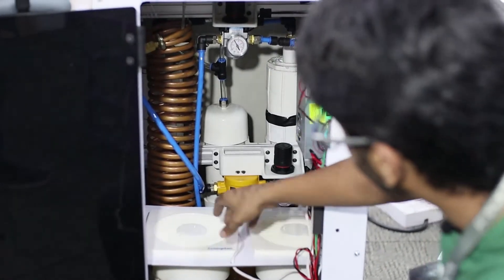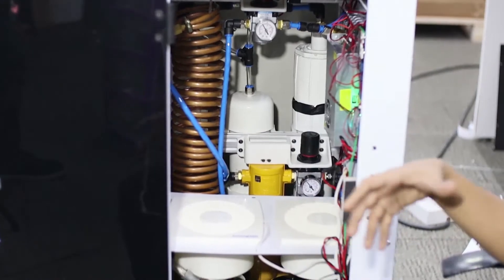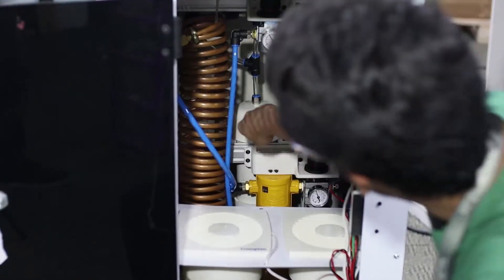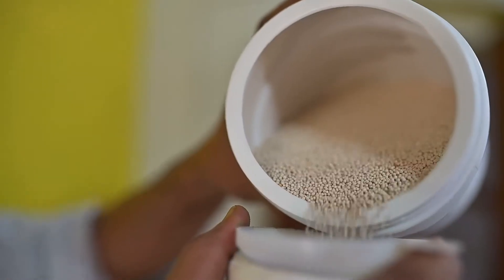After the moisture separator which removes all the moisture, we have the pressure regulator which is regulating the pressure going into the system. Then at the back we have these two sieves. This is where we have the molecular sieves, the zeolite.